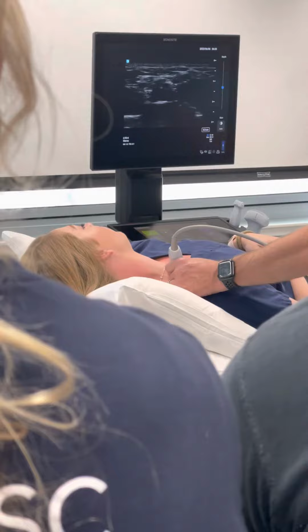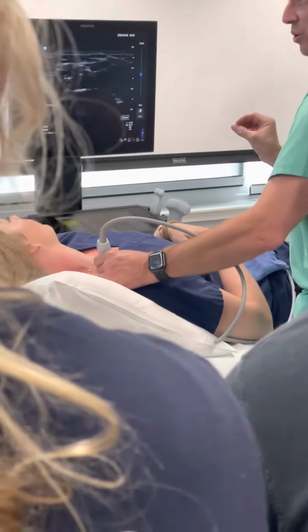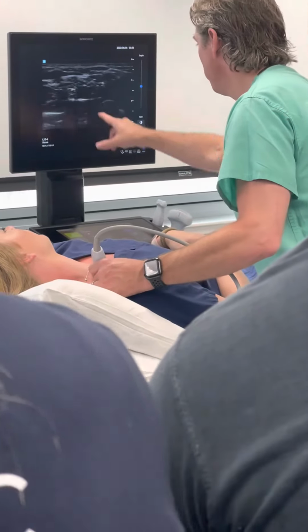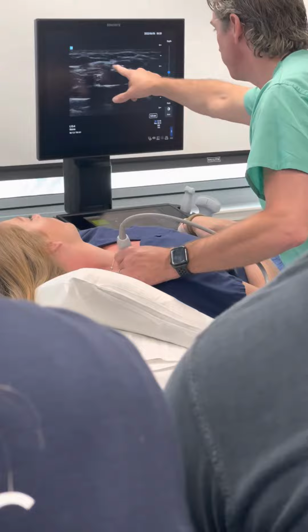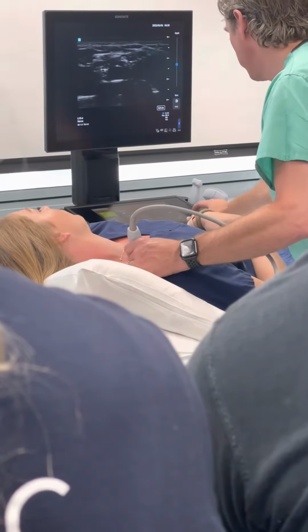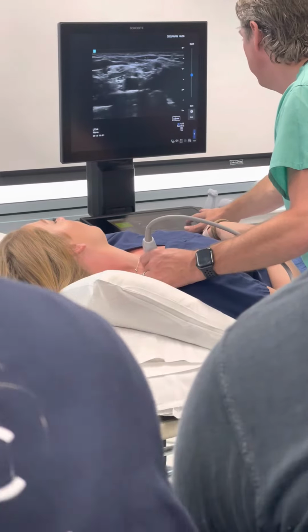And the reason we're trying to visualize is because we're trying to actively avoid those structures, right? We don't want to drive a needle into the lung if we can avoid it. But we're still really not kind of seeing this center targeted area. We can kind of see the edges of the artery, but not perfect. So let's go ahead, let's take our midfield up.